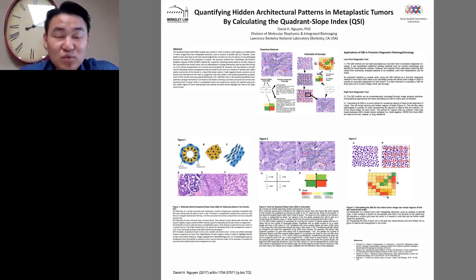And so each of these squares has 4 quadrants that result from an XY axis. You can simply trace the longest length of each nucleus, and the slope of that line will either point up, a positive slope, or point down, a negative slope, with the bottom of the image being the reference, parallel with the horizontal x-axis.